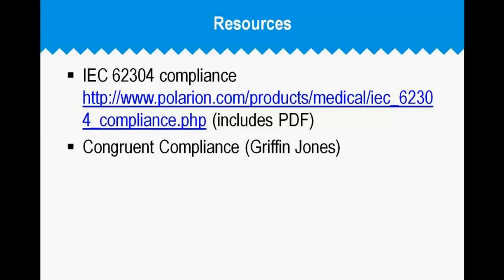When I look back at some of the people that have started to implement it, one of the more interesting aspects is dealing with all the post-software development aspects of 62304. The maintenance aspects and the retirement aspects that are called out by the standard are things that are easy to brush over, but actually end up being fairly critical as you go into an operational phase. So those are my thoughts.